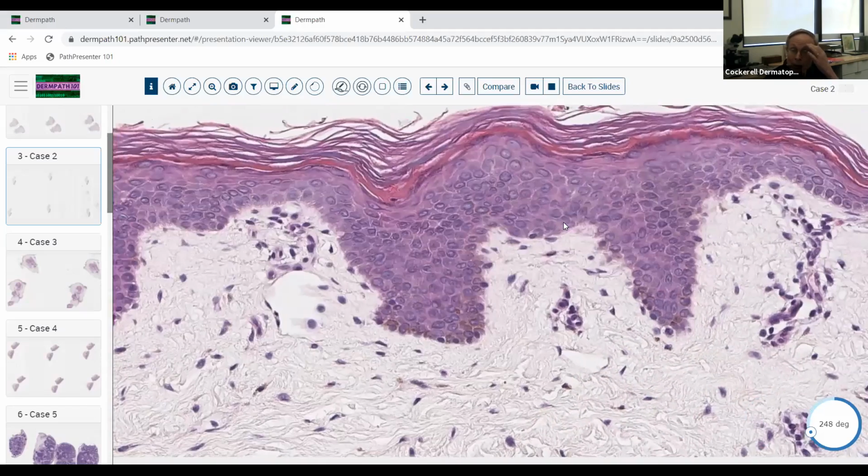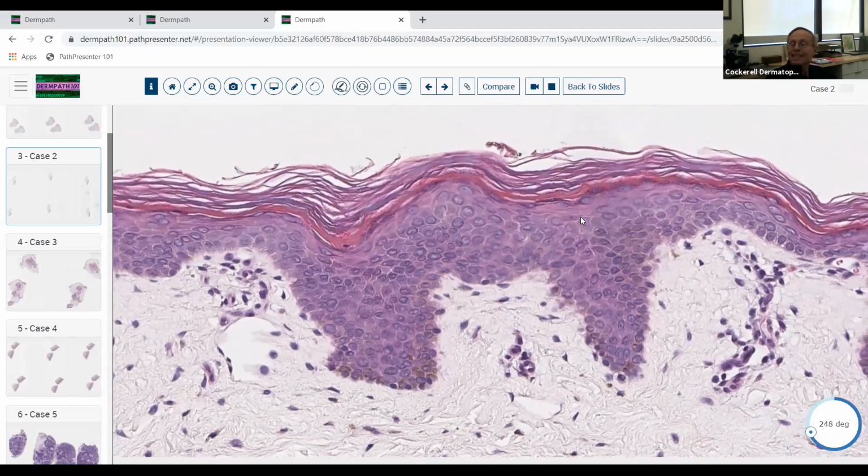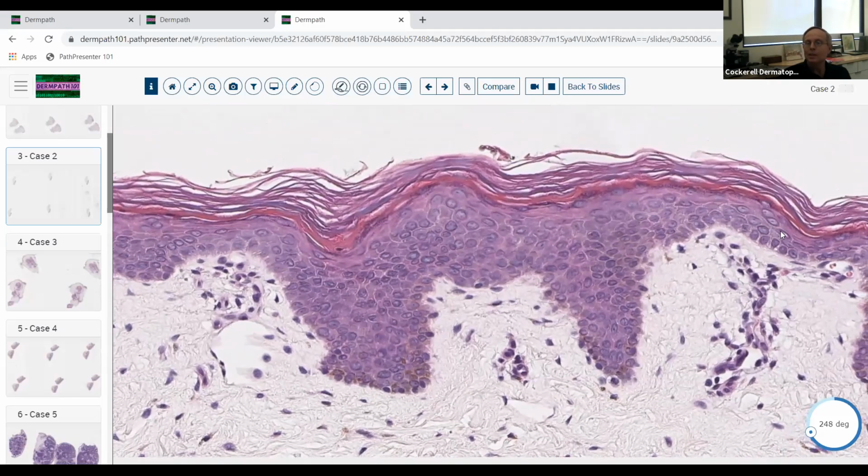So if you had a multiple choice type of question here, they would give you some information, maybe they'd say this is a 70-year-old person that came in to see you with some itchy skin, and they admitted to bathing twice a day, and it was in the wintertime, and this biopsy was taken, what would be the best diagnosis?